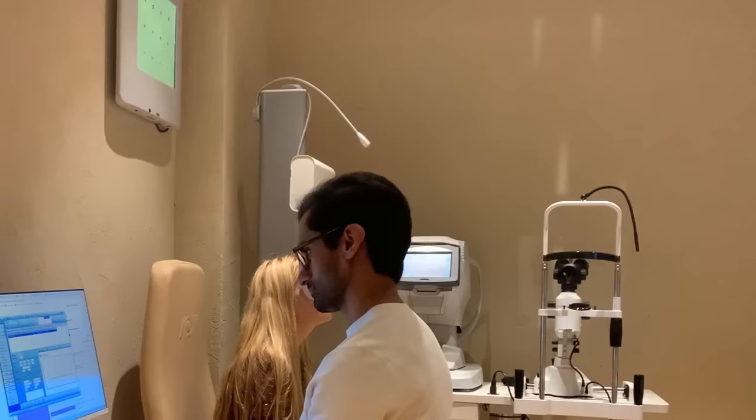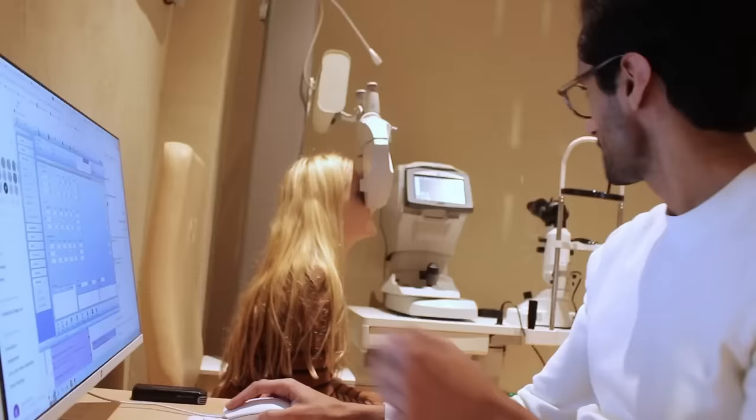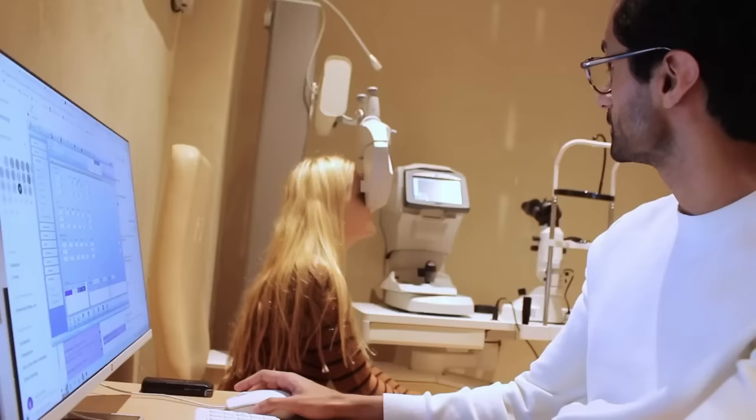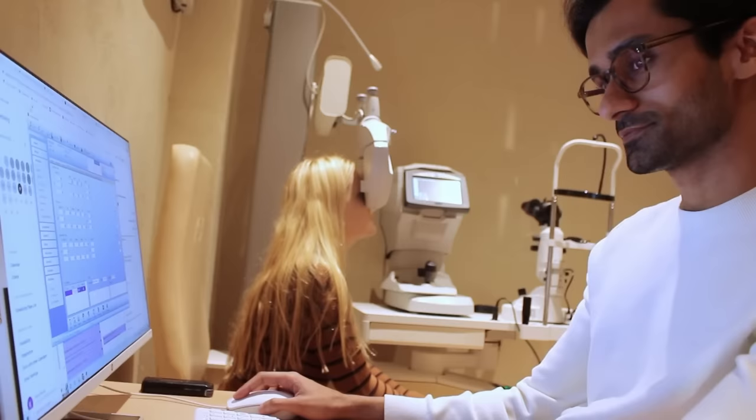Okay. So I'm going to put some lenses in now. Is that better? That's so much better. Yeah, you can go for the last line. Yeah, I think so. L, C, N, K. Okay, so I'll show you two lenses now. You tell me which one is better. That's one. And that's two. That's one. And that's two. I think two is better. Okay.